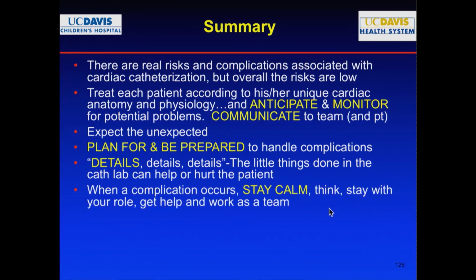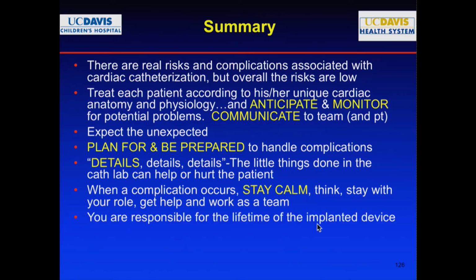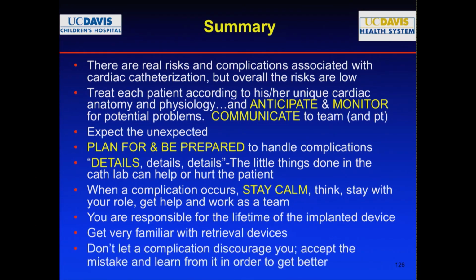When the complication occurs, stay calm. I think I said that several times. Think and stay with your role. Get help and work as a team. You are responsible for the lifetime of the implanted device. That's why it's not over even after it's over, because you're going to be responsible for that. Get very familiar with retrieval devices. Don't let a complication discourage you. Accept the mistake and don't point the finger to somebody else or act of God. It's your mistake, but learn from it so that you can get better. Thank you.